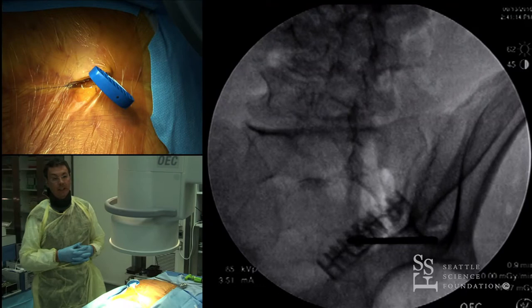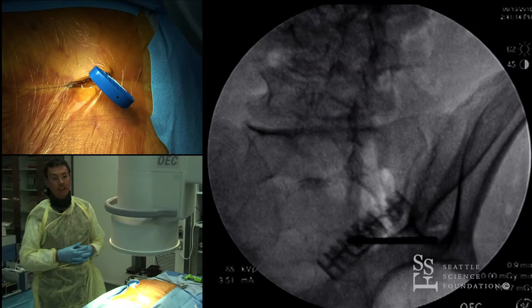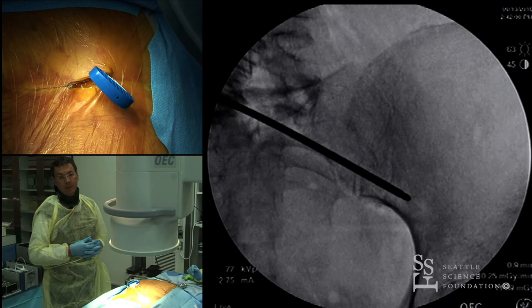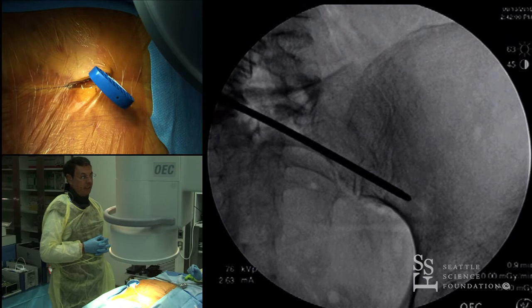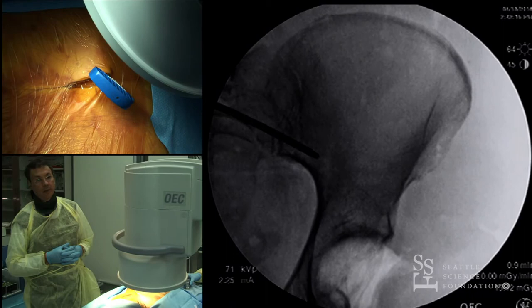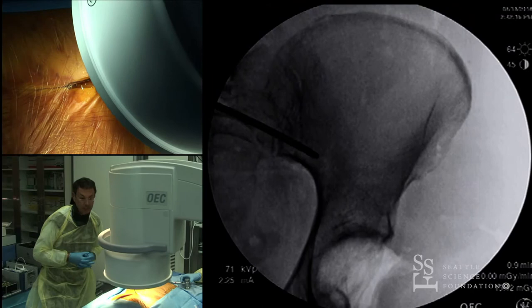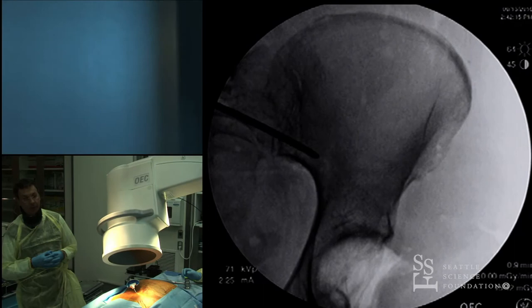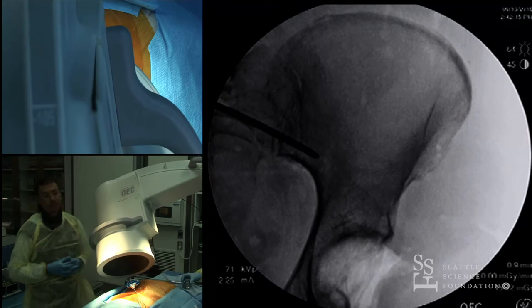You advance the Jamshidi needle, making sure you are into bone. Take an AP again at five to ten degrees inlet view and confirm you are as close as possible to the sciatic notch. Lower the fluoroscopy machine so you can see the acetabulum — your direction should ideally be through the acetabulum or the top part of it. The closer you are to the sciatic notch the better, because that's cortical bone and your purchase will be much better.